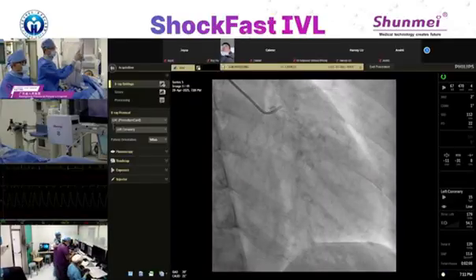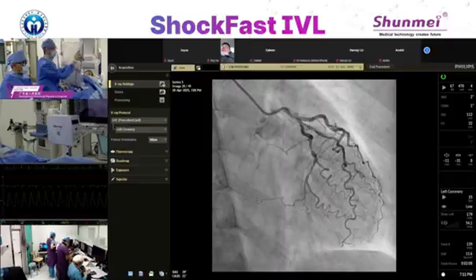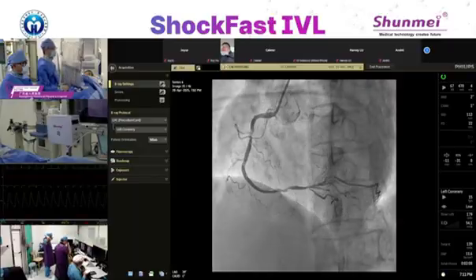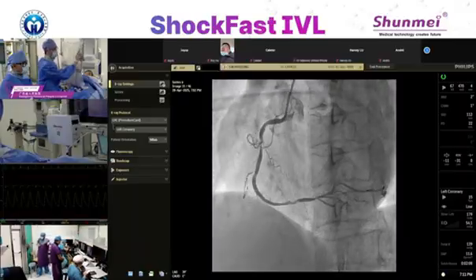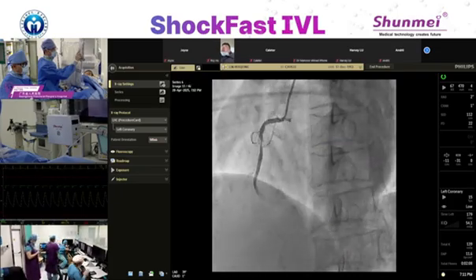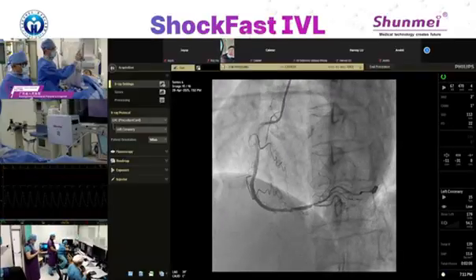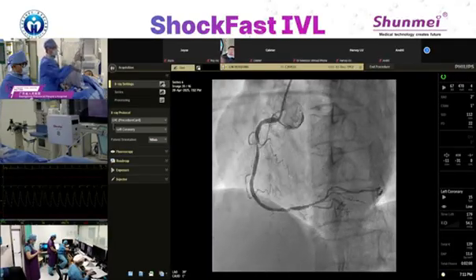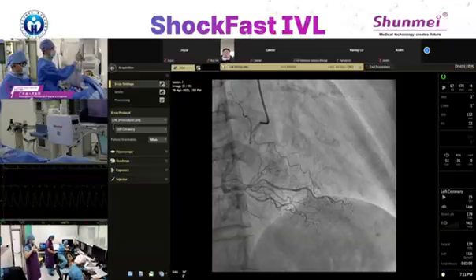This view is more clear. The vessels are tortuous. And for the right coronary artery, I'm sorry, the catheter is deep seated, and at the proximal and the distal, as well as at the distal bifurcation, there is some focal stenosis, and the vessel wall is kind of calcified over here. So this time, I decided to treat the right coronary artery first.